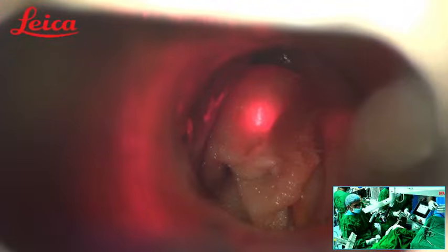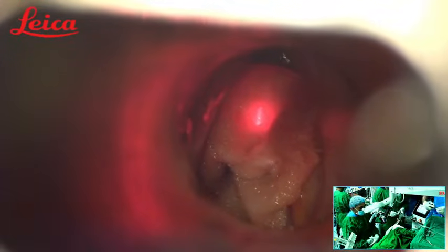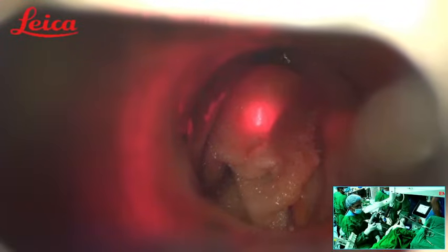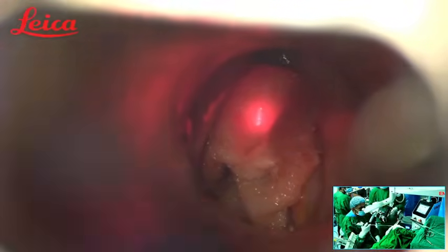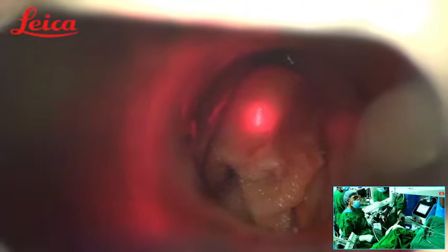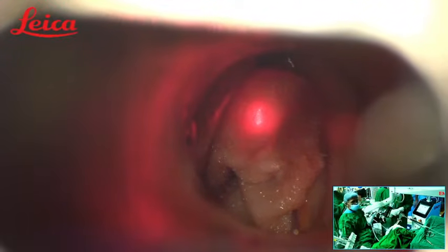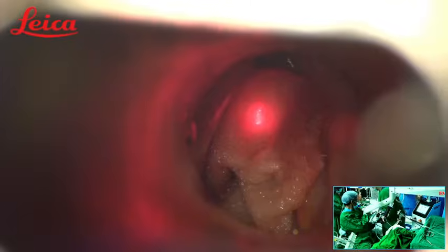We have put an incision and we have incised, removed a thick kind of a glue that was there. It is myxomatous material, we call it as submucosally. The exudate which will be there on the superficial lamina propria. That space is called the Reinke space.